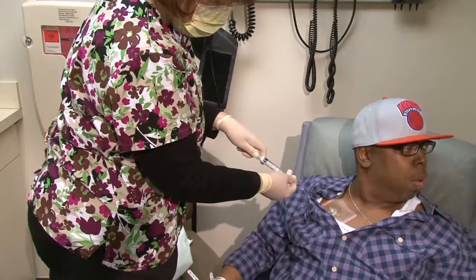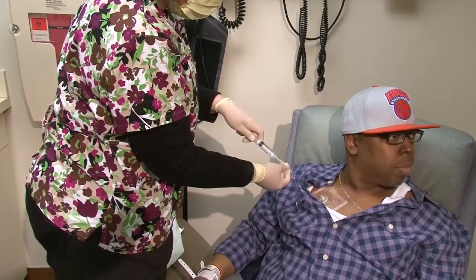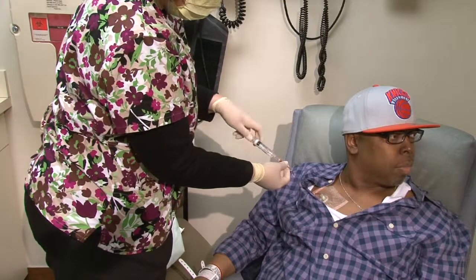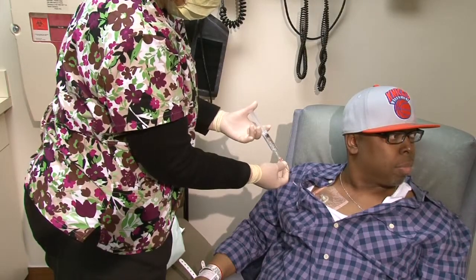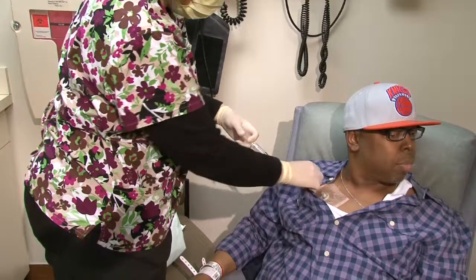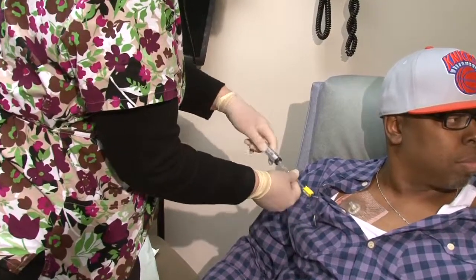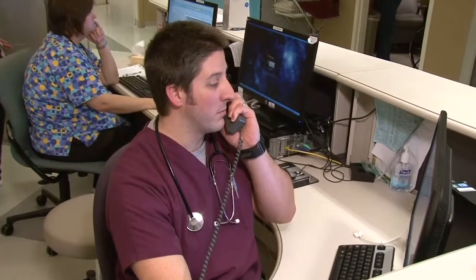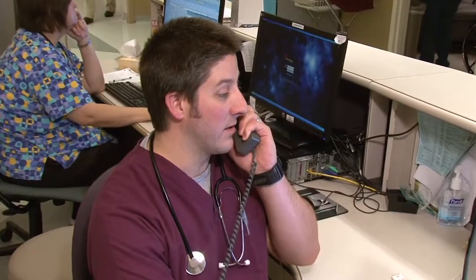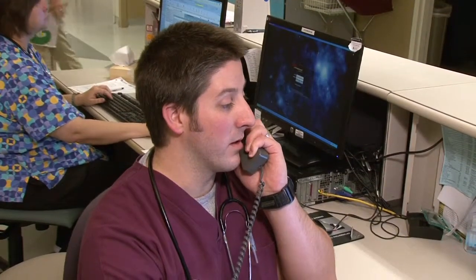If you have a port, the care provider may change the access needle. If these techniques do not solve the problem and the line remains difficult to flush or to draw blood from, the care provider might change the dressing. Sometimes the movement of scrubbing the site helps shift the position of the catheter and resolve the issue. If none of these steps open the line, the care provider will consult with your physician to consider what next steps should be taken to clear the occluded line.